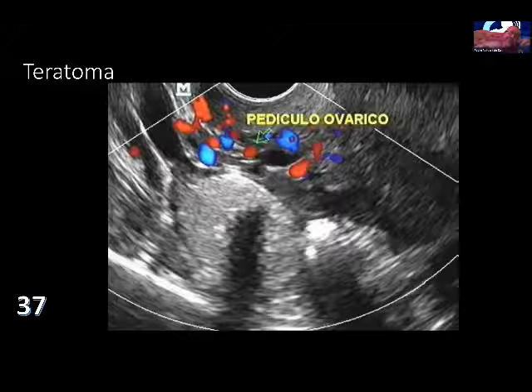Sometimes those masses or any ovary that enlarges can twist. It's like having a fruit on a tree. The bigger they get, they do this. We have to see the ovarian blood vessels.